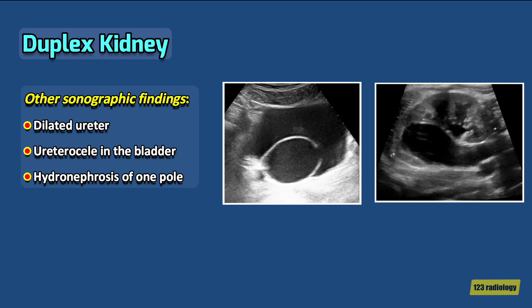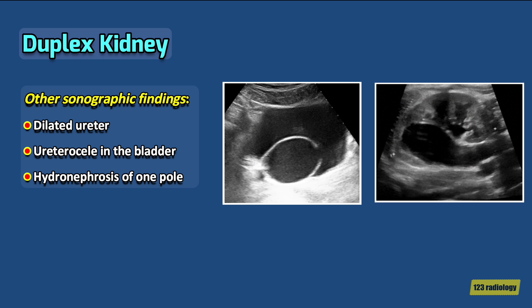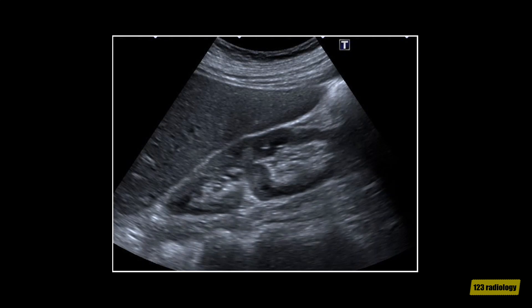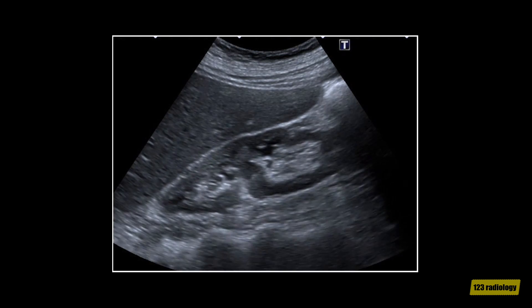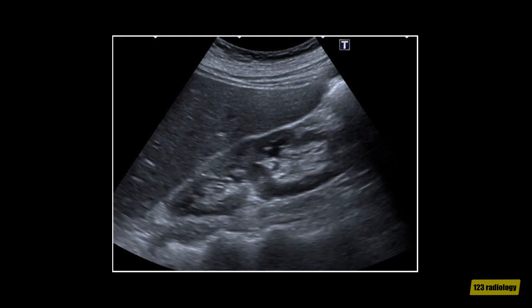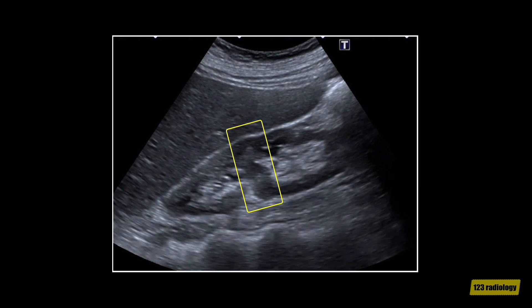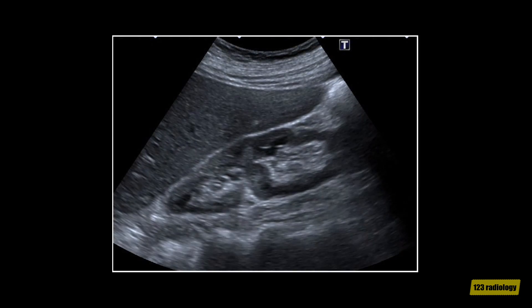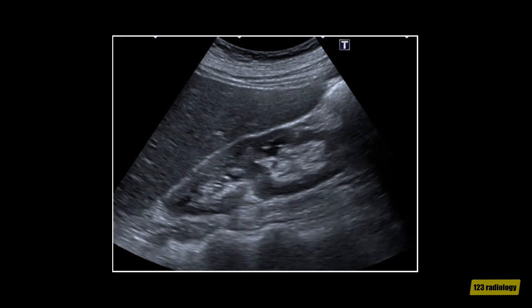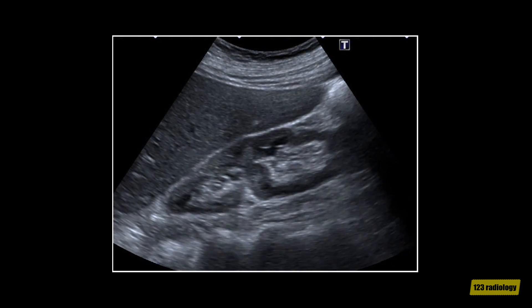Other sonographic findings suggestive of duplex kidney include a dilated ureter, the presence of a ureterocele in the bladder, or significant hydronephrosis of one pole of the kidney. The presence of more than one of these features increases the likelihood of a duplex kidney. This is a video clip of a longitudinal ultrasound examination of the right kidney. It shows two central echogenic renal sinuses with intervening bridging renal parenchyma, suggestive of duplex kidney. No evidence of hydronephrosis in either renal sinus.